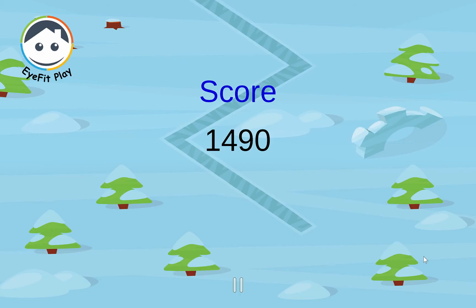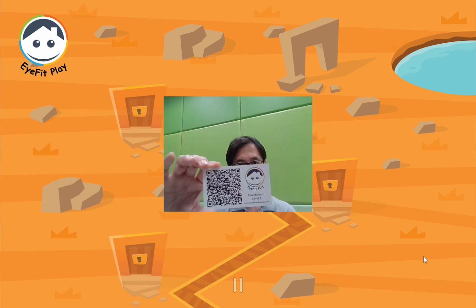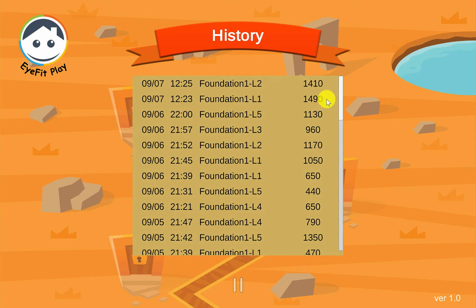Yay! After the game, it will go back to the QR code scanning window. It is now ready for scanning another QR code to start another training game. You may also check the score history by clicking the button here in the main menu.